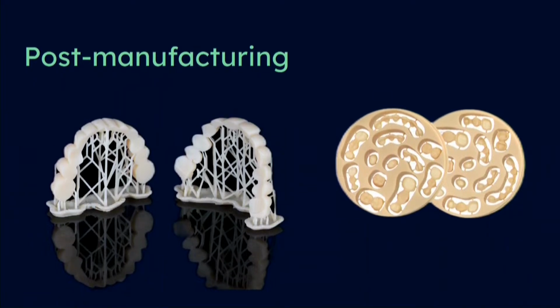This is then followed by a specific curing protocol, which may or may not involve heat. Errors in washing protocol can lead to dimensional errors, while errors in curing protocol can lead to errors in the physical properties of the material. The right-hand image shows milled pucks. Depending on the material, specific post-processing protocols must be done for the material to reach its final dimensional and physical state.